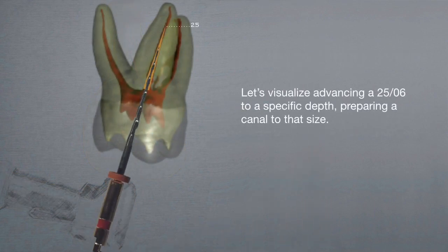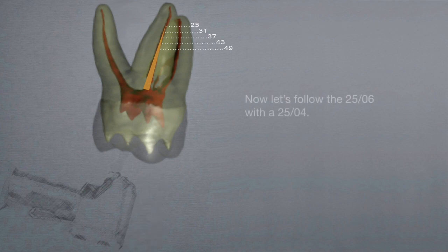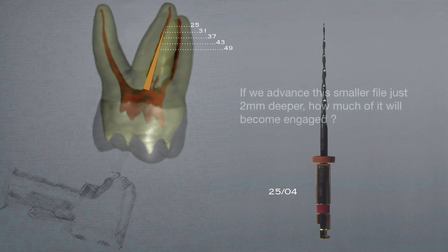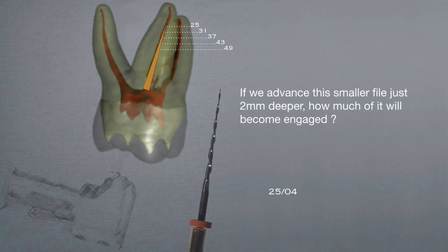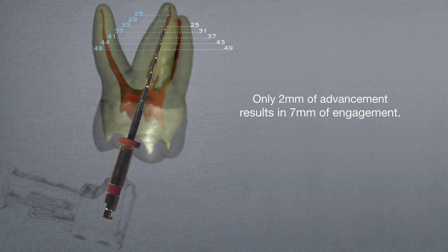Let's visualize advancing a 2506 to a specific depth, preparing a canal to that size. Now let's follow the 2506 with a 2504. If we advance this smaller file just 2 millimeters deeper, how much of it will become engaged? Only 2 millimeters of advancement results in 7 millimeters of engagement.